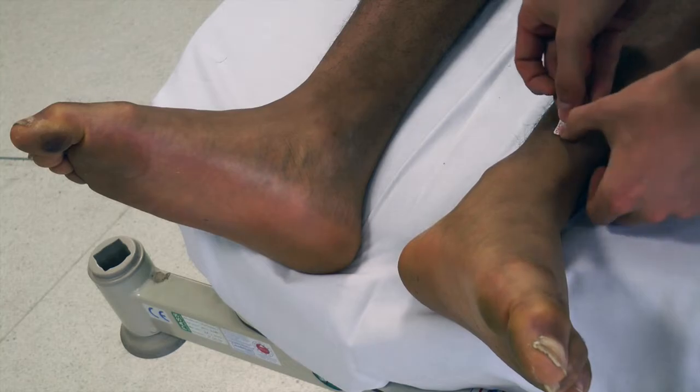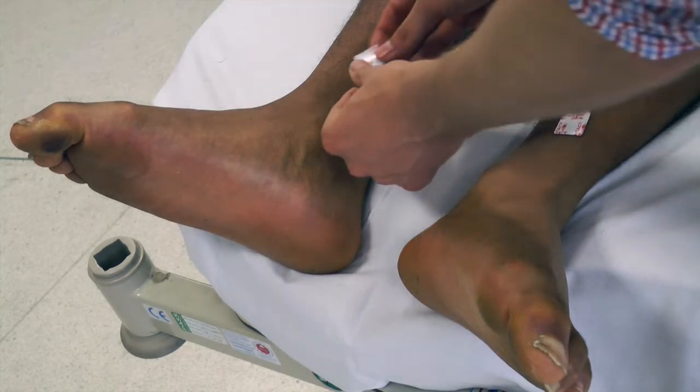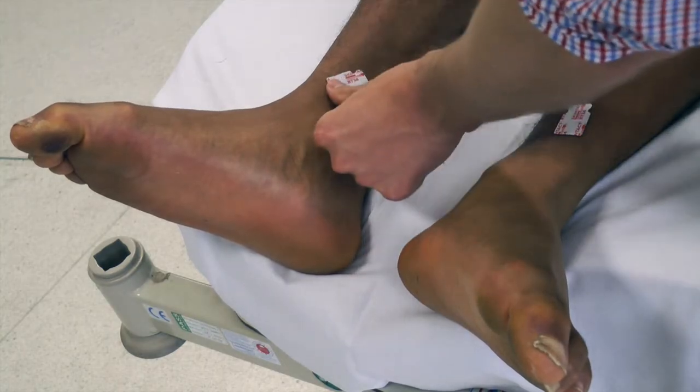Place the limb leads on the ankles and on the wrists. Ensure the ankle attachments are facing upwards and the wrist attachments are facing downwards.